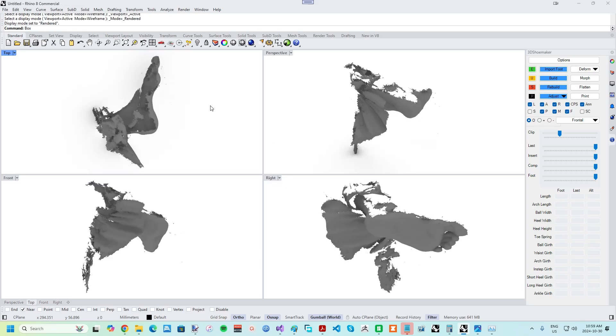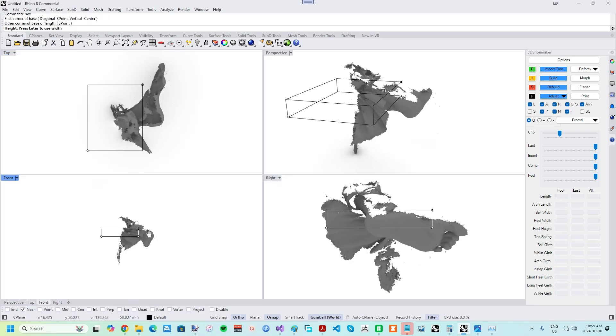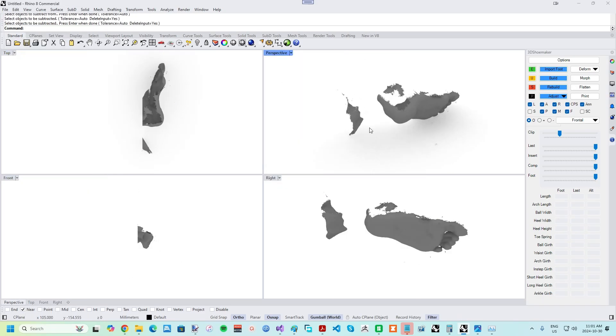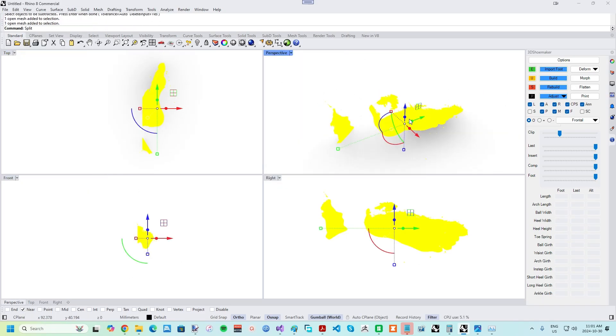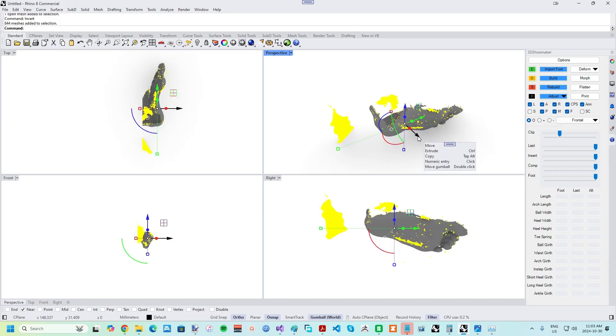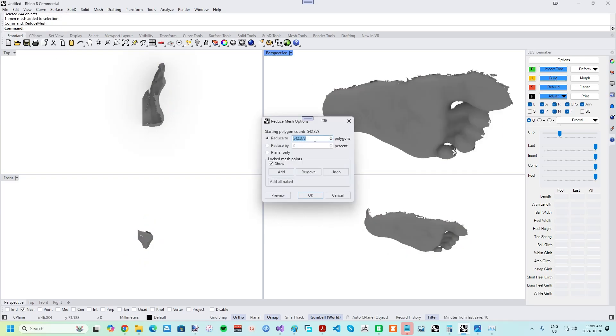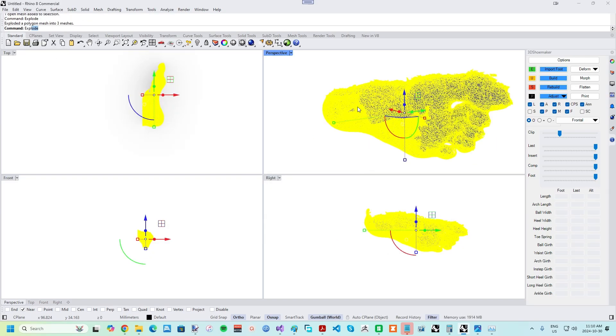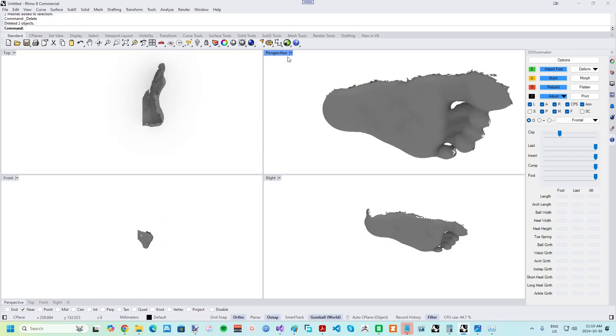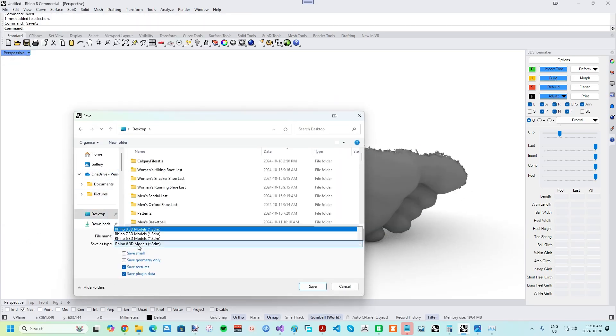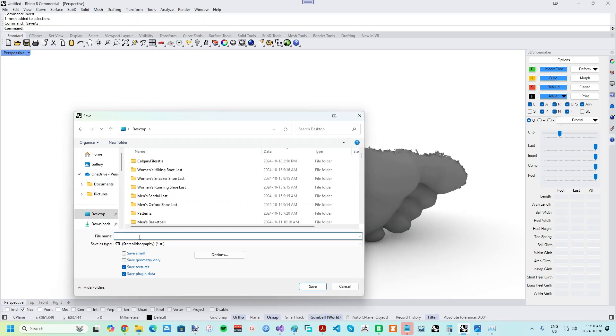Depending on the quality of your scan, which should ideally be in STL format, you might need to do a bit of cleanup before importing into 3D Shoemaker. The commands split, disjoint mesh, reduce mesh, and mesh boolean difference, and explode in Rhino can help get rid of unneeded parts of the scan.